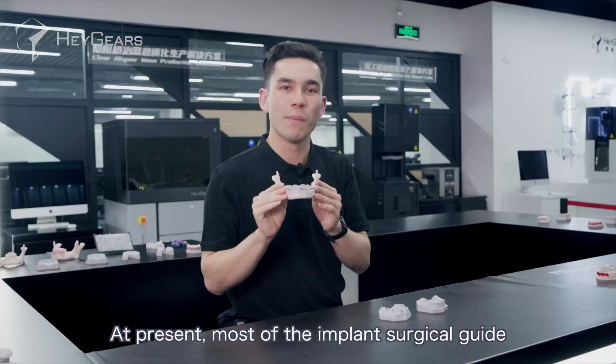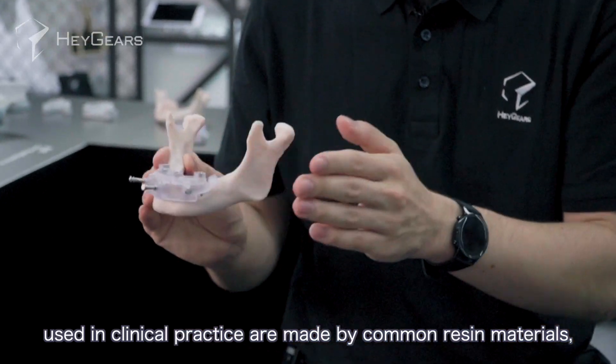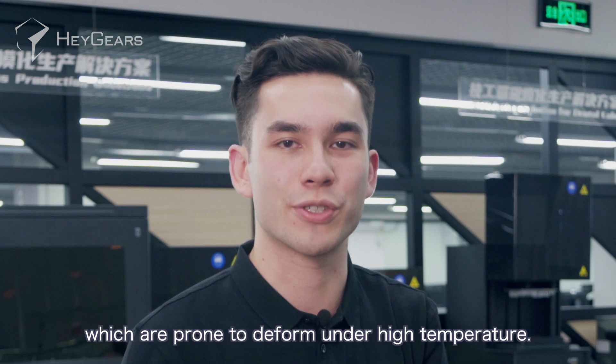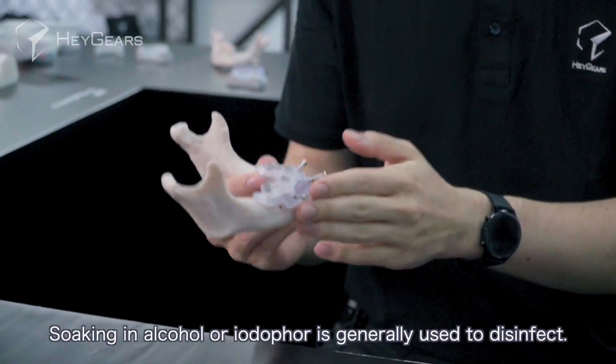At present, most of the implant surgical guides used in clinical practice are made by common resin materials, which are prone to deform under high temperatures. Soaking in alcohol or iodophor is generally used to disinfect.